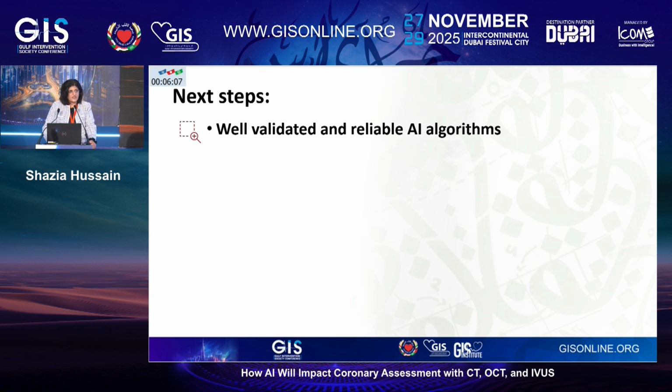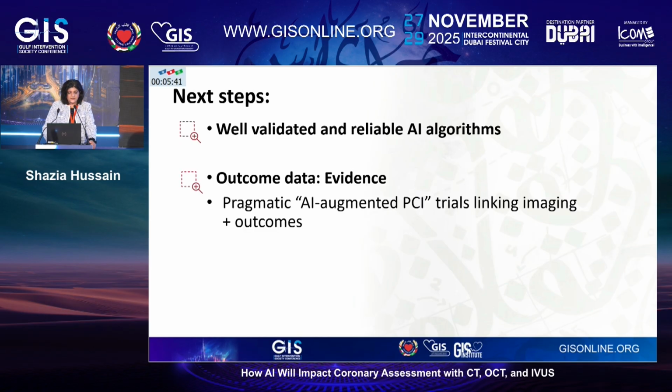We've gone through the current technologies, we've gone through what is being developed and what the future looks like. The next steps are important, as without validation, there is no point in having these technologies, and everything needs to be rigorously tested and reliable. We know there are errors in AI interpretation, so we need to ensure that they don't impact on our patients. We also need outcome data.